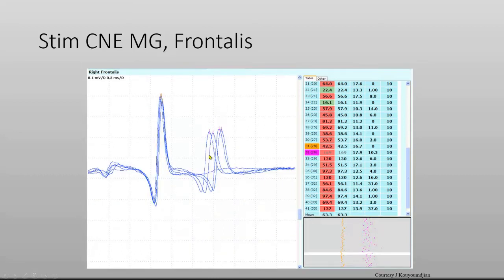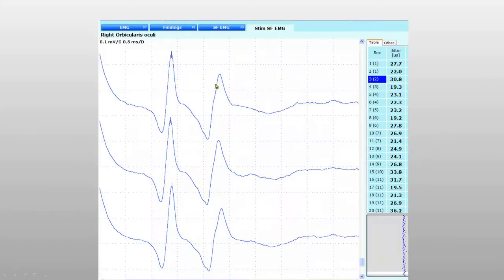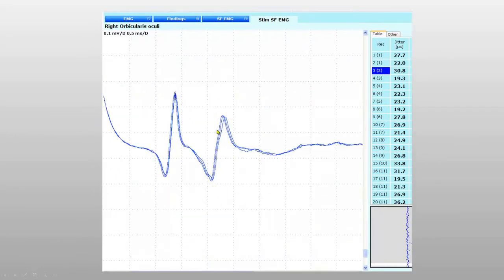Here's a superimposition of the same recording. This is a situation where this spike is not a clean single fiber recording, but you can see clearly that it must be a summation of two muscle fibers. And since this occurs above the 50% line of the spike, we do not accept this recording. We have a summated influence here from the two fibers. It's not a clean recording.